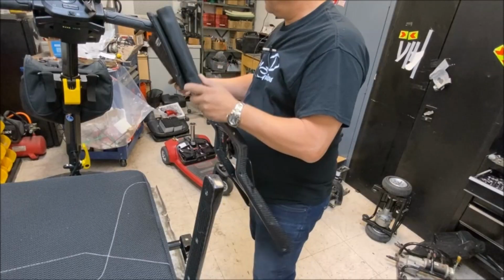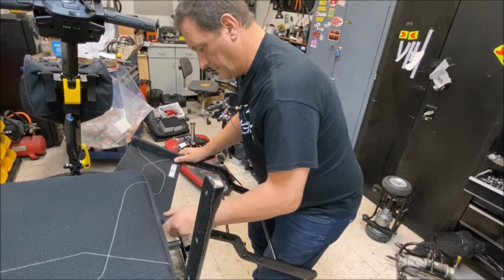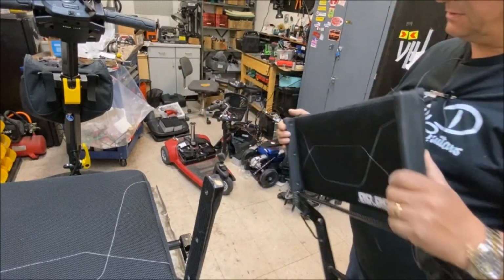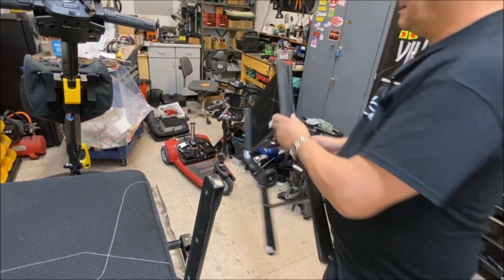Put the backrest on the new bit. A bit tight, but it's doable. Slide that down. So yeah, not much going on in the store, as I said earlier. So just got to line up the screw holes and then put the screws back in there.